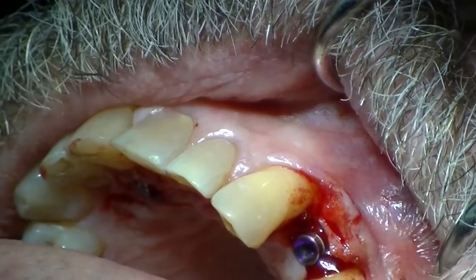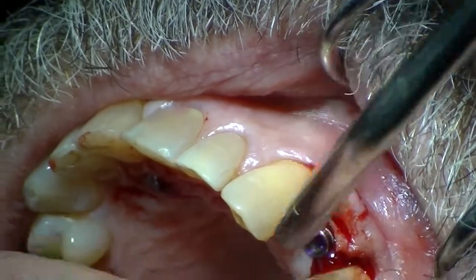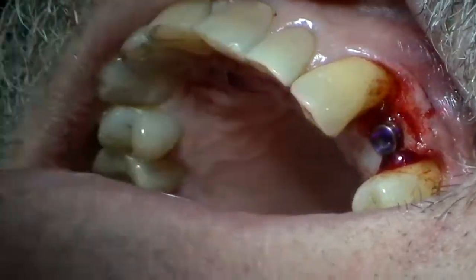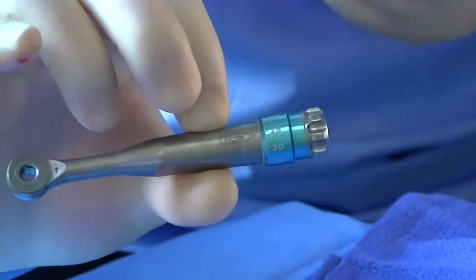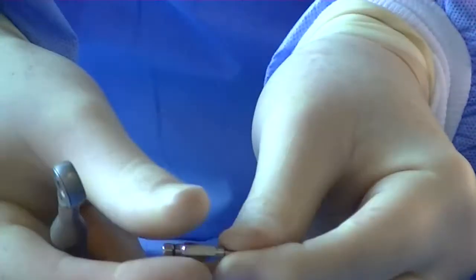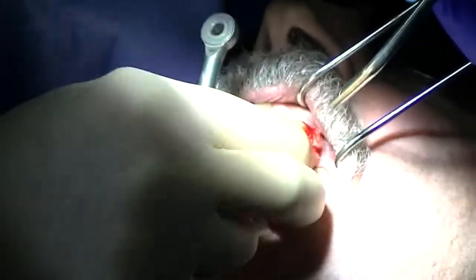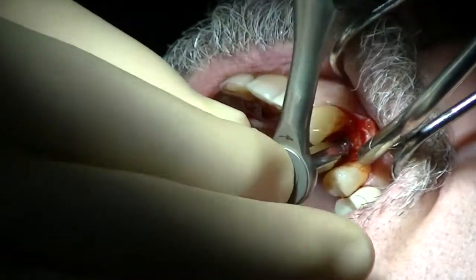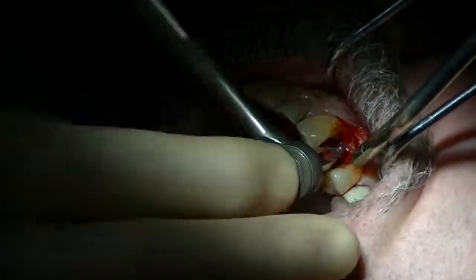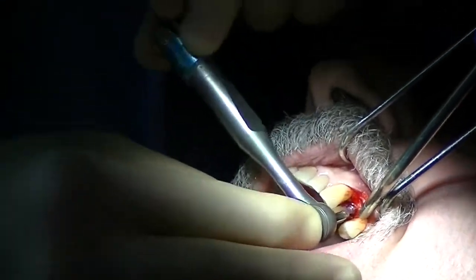We will simply take our torque wrench. And remember, I don't care so much about torque, I care mostly about position. So my torque wrench here is set at 25 Newton centimeters. That's where we torqued out. I'm going to take my inserting tool and my extender, and I'm going to go to site, engage, and then place my torque wrench in the position, and turn to me just a hair. Thank you.